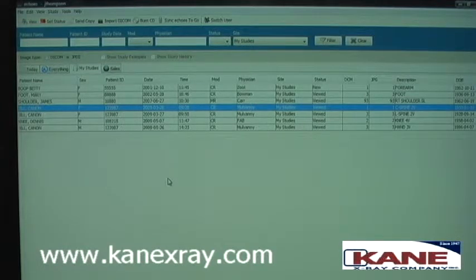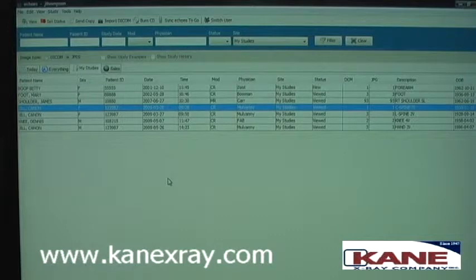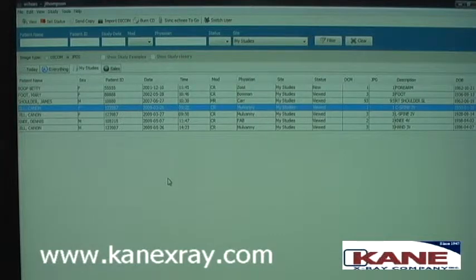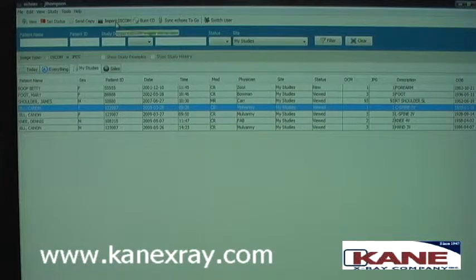If you receive a CD from a referring physician or another location and you'd like to import it into your server, simply hit the import DICOM button.